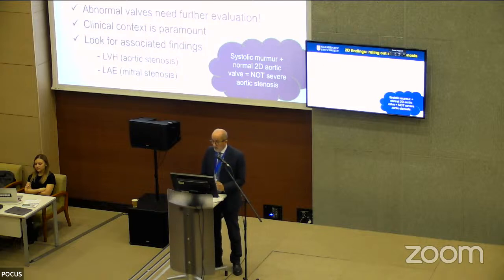For example, a normal valve appearance on 2D images is a good rule out for severe aortic or mitral stenosis.